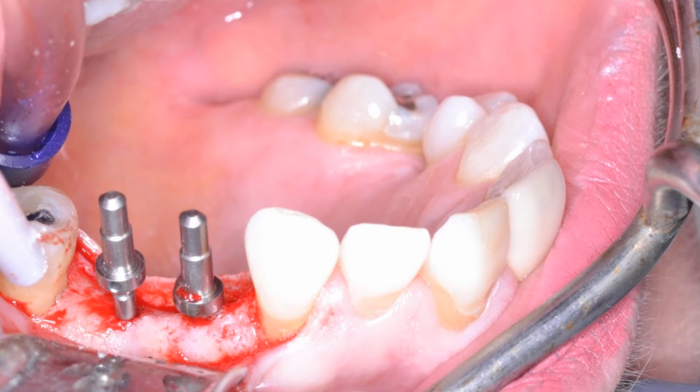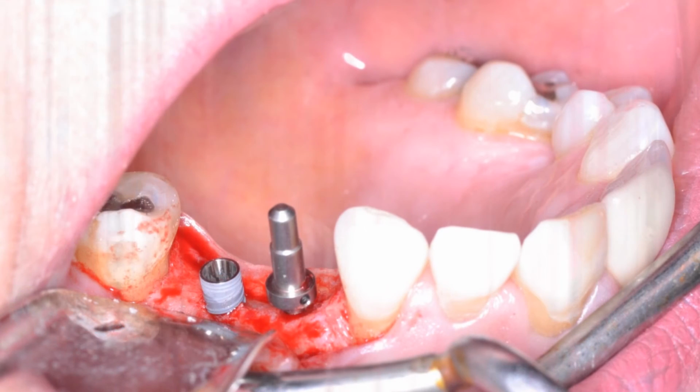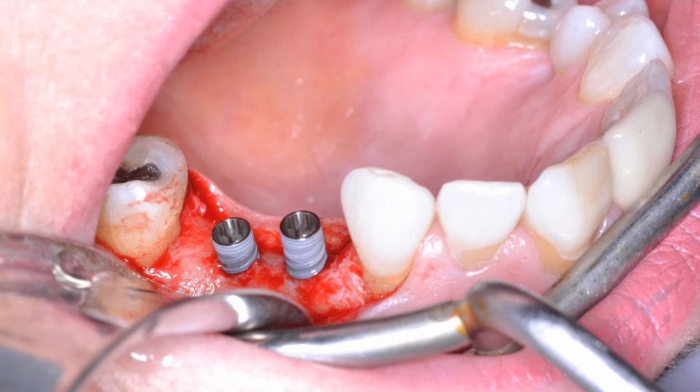Now, you can appreciate from the subsequent radiographs that the second pilot drill or second implant was not going to be the same size. You also have to make sure that the implants are spaced far enough apart so that you're not going to end up causing issues by having them too close together. And in this picture here, you can see that we used that osteotomy to place the first Nobel Active implant using the hand driver in this particular case. And then once again, go ahead and place the second implant.